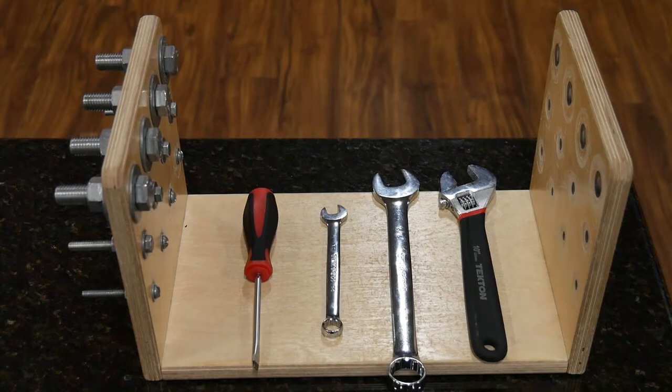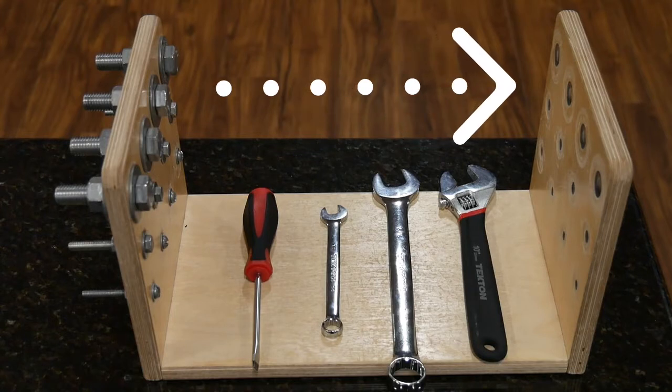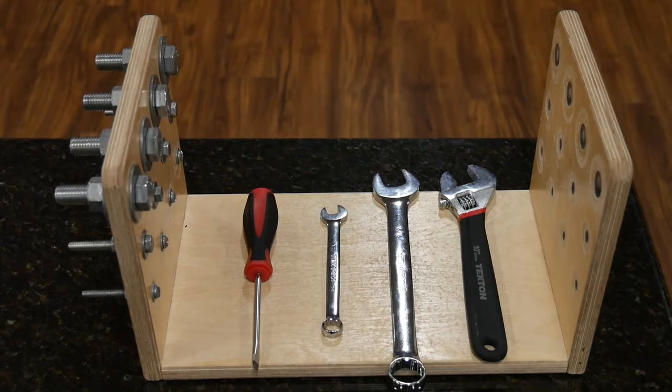This is the view that the examinee would have, with the nuts and bolts on the left, and they're going to disassemble them and end up moving them to the right. Instruct the examinee to start with the top row, break them loose with the tools, then use their fingers to finish disassembling them. They must remove all the nuts and bolts from the top row completely before moving on to the middle row, then break loose the middle row and disassemble, then move to the bottom row — one row at a time from top to bottom.